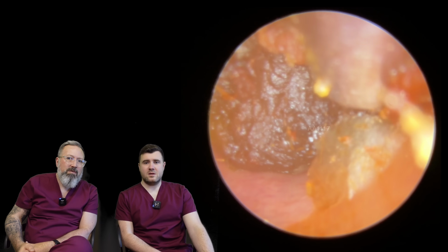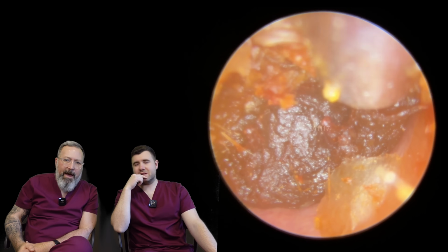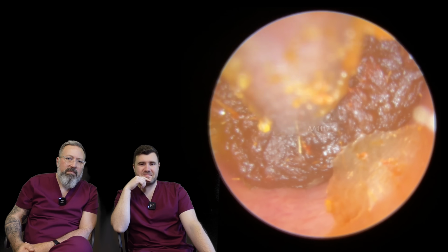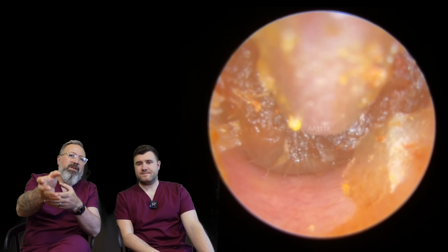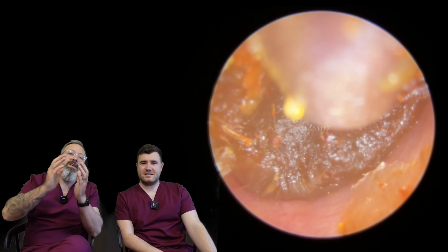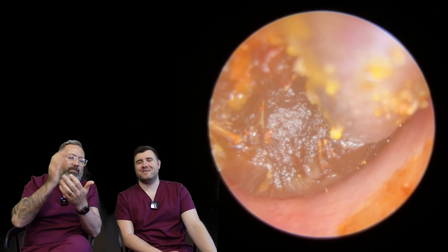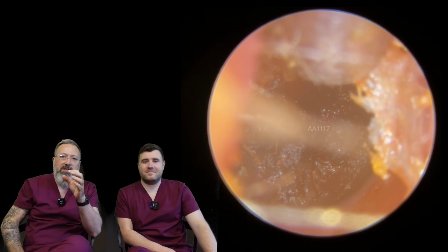There we go. Yeah, you generally tend to find you've got to attack these early with oil, haven't you? Normally these gluey, sticky ones. And I don't know if you find the same, but when you've got a narrow canal like this, you think, oh yeah, oil, that's going to get in there and loosen it. But then you think about that very narrow entrance, and as soon as you put the endoscope in, boom, you lose your visual straight away. It's not the easiest of things to do.